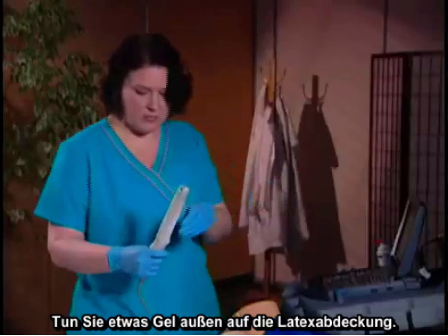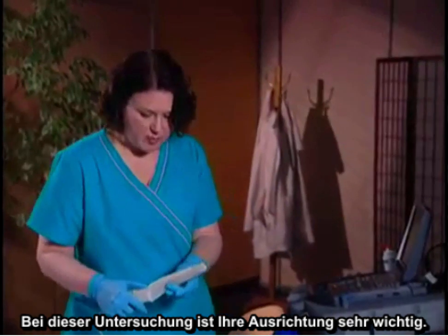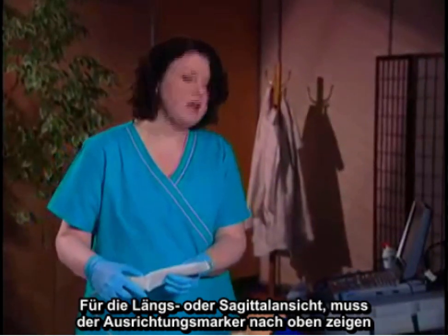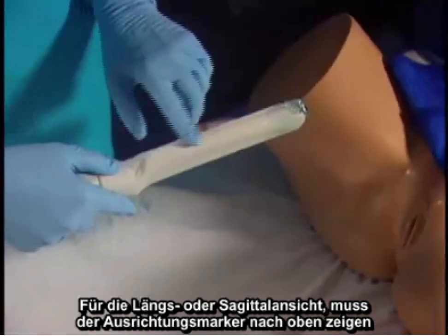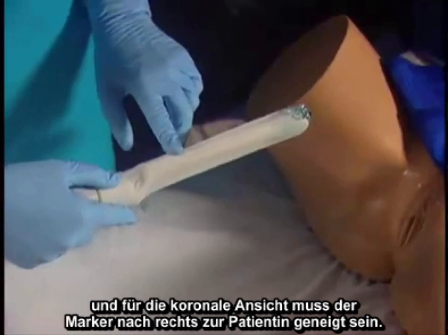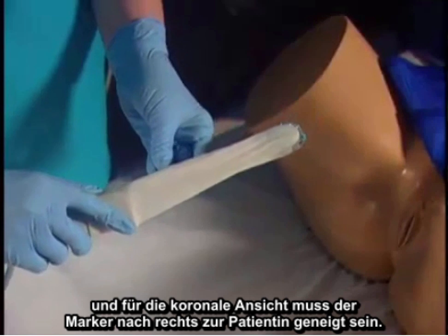Orientation for this examination is very important. For the long axis or sagittal view, we want the orientation marker up. When we go to the coronal view, we're going to turn that so it faces the patient's right.